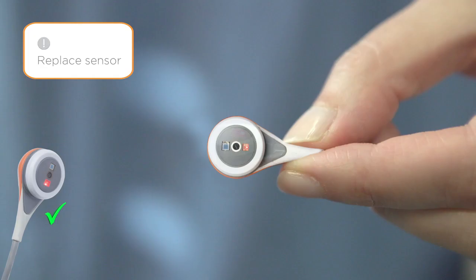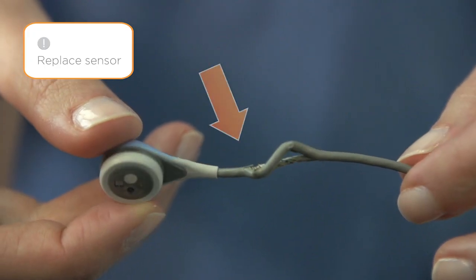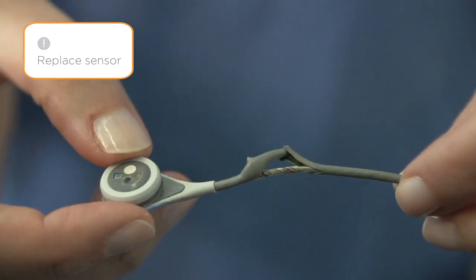Inspect the sensor for the following issues which require sensor replacement. If the ring has a white or metallic luster, the sensor has exceeded its lifetime and cannot be used. If there is any damage to the sensor housing or sensor cable, do not use the sensor for patient monitoring.